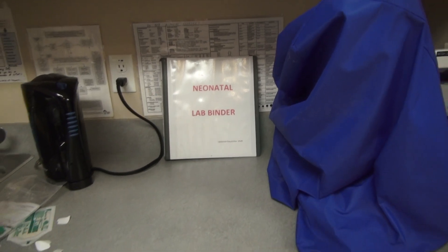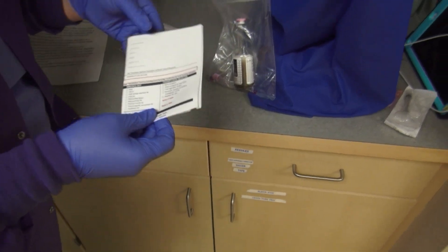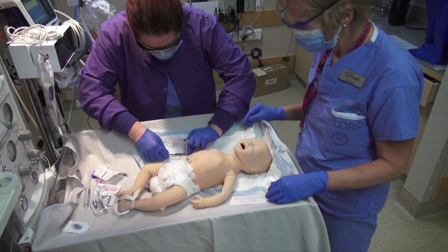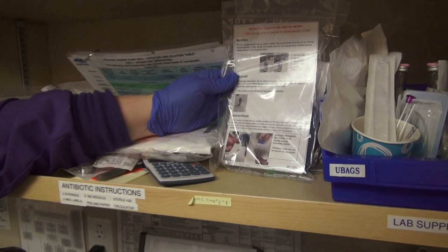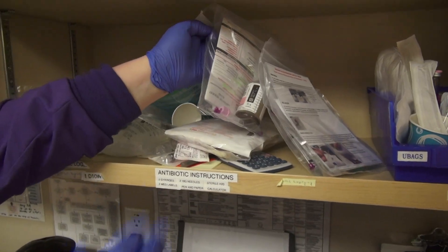Another resource available for staff is a pre-prepared newborn blood collection kit. This includes a pre-filled requisition for a CBC, blood culture, and acute capillary blood gas. If the pediatrician has ordered additional blood work, please refer to the neonatal lab binder. Included in the pre-made newborn kit is a quick reference guide for neonatal blood collection.